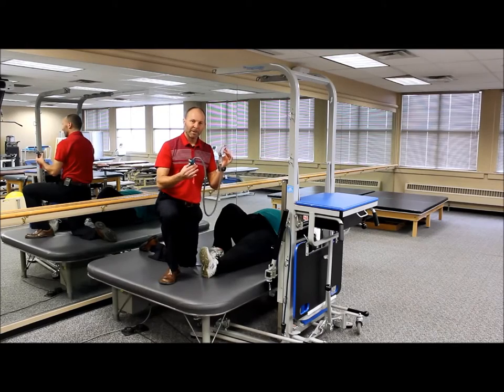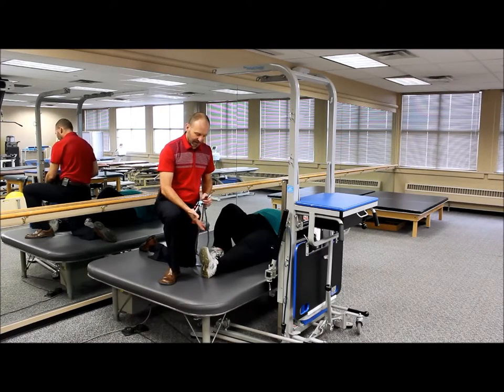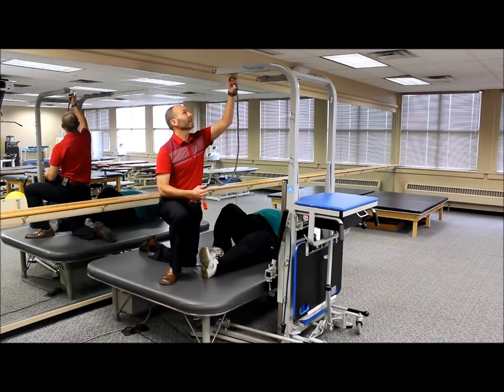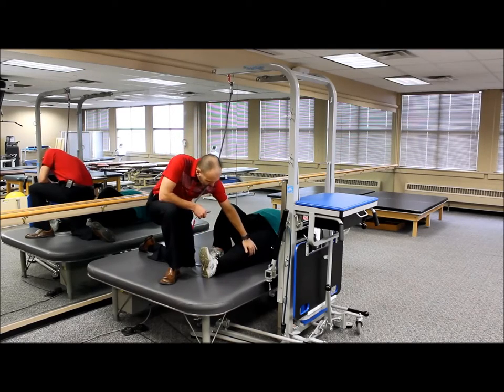We can also use some of the drop lines that we use for the balance harness for some other activities, including stretching and for the lower body. So what we're going to do is take this and attach it to our upper support structure. This might be for somebody who's got a subtle knee flexor contracture and you're wanting to gain a little bit of a stretch there.